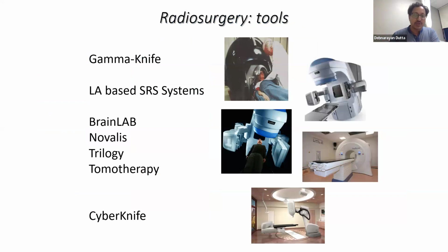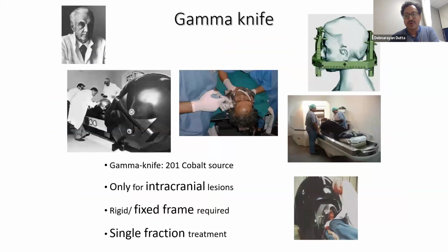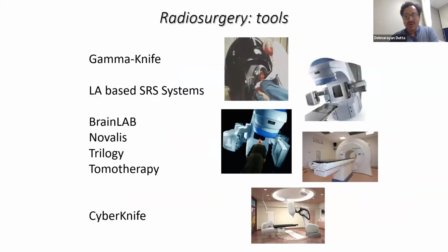When you talk about the radiosurgery tools, there are gamma knife, the linear accelerator based BrainLab, Novalis, Trilogy, CyberKnife. So many things are there. Because it is something new for the students, we will have a small discussion about it.